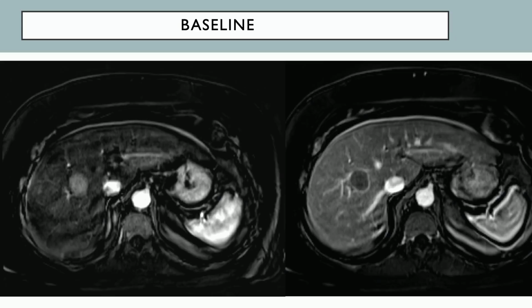And I'm not showing you all the images. Well, the hepatic veins and the portal veins, if you actually looked at the whole cine, they would come very, very close. And obviously, all of us are fans of Y90. That's why we're here. But I've seen cases where you can knock out the whole hepatic vein or the portal vein with a microwave ablation. Sure. Not the main hepatic vein or the portal, but a major branch of it.